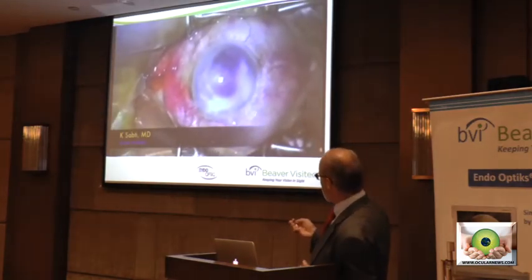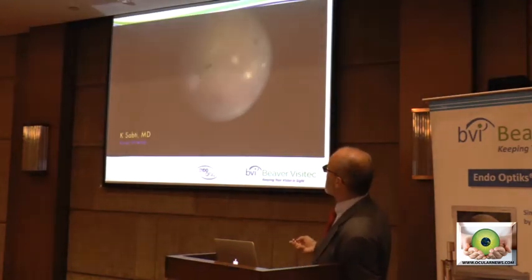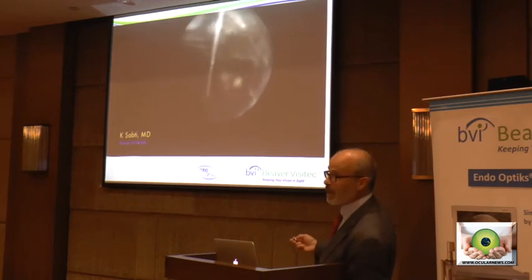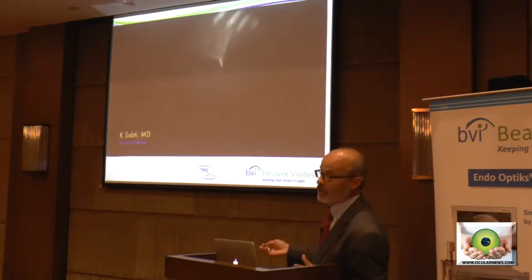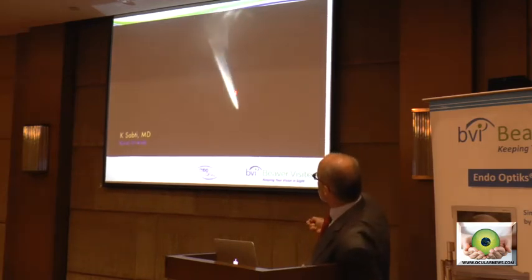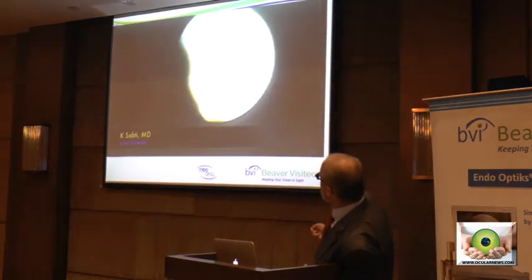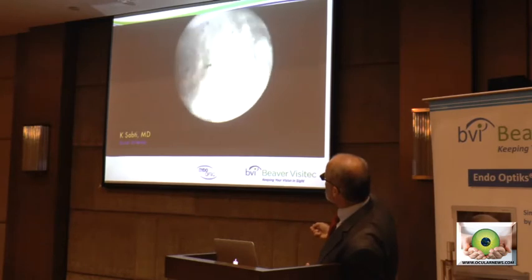So this is the kind of eye that through the operating microscope would obviously be challenging, but with the endoscope, this is a first generation 6,000 pixel endoscope, and even with that, he's able to have a panoramic view to determine that surgery is indicated here. You can see the sclerotomy being fashioned. You'll note that he's going to do a start of vitrectomy here.